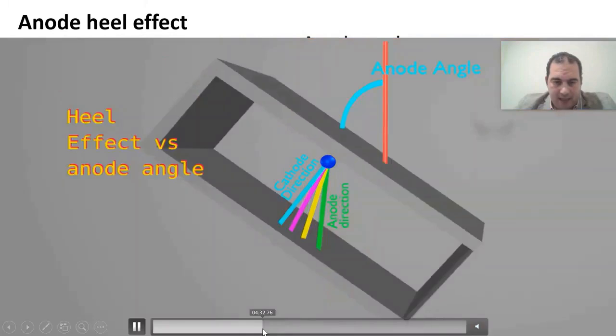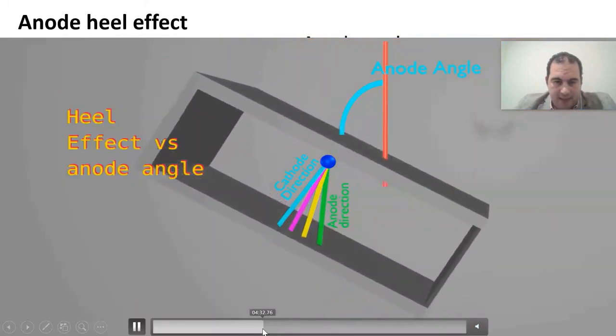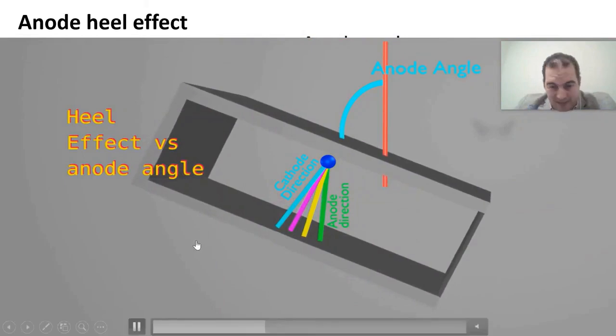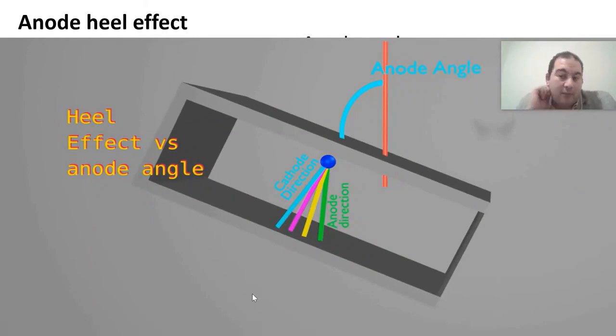Now, if I increase the anode angle, what effect will that have? If I increase the anode angle, it could potentially alter the distribution of intensity, leading to changes in the overall behavior of the system. This adjustment might affect how the signal propagates through the medium, possibly enhancing or diminishing certain characteristics.